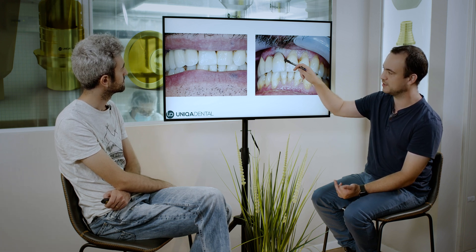So that's what we talked about before — the T-base corner is cut, so the cut gives us the option to move the crown palatally, which gives us more aesthetic options. Because of this option, we can move both crowns to the same level. And here you can see the zirconia crown — you almost don't see the screw channel. Maybe you see it because you're a dentist, and it's the first day we look at the result. With time you'll see a little bit of difference, so maybe in five or ten years you'll want to change the composite material that closes the screw channel. But in the next few years it won't be seen. Even when the patient smiles, you don't see it. In the final work, we moved the crown — and because we had this space in the buccal area, we moved the crown more palatally, so both teeth are almost on the same level, even though the original teeth were not.